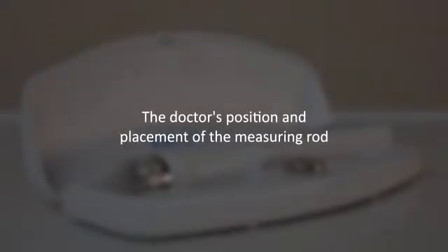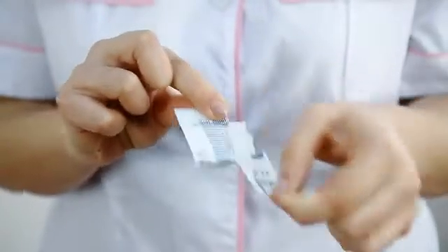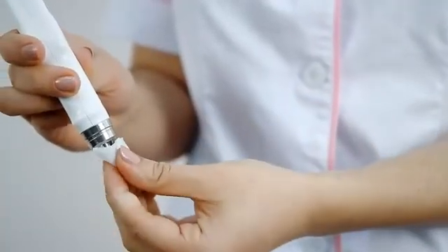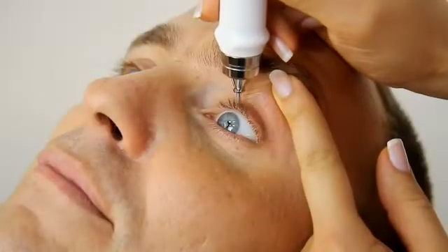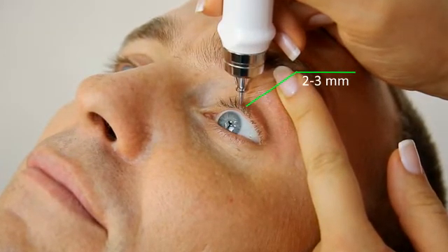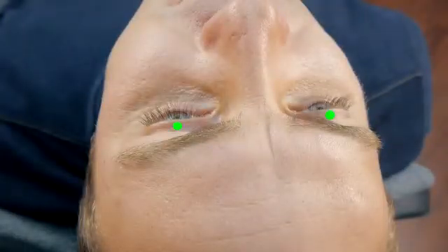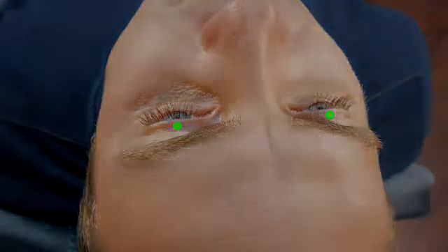The doctor's position and placement of the measuring rod. Please make sure to disinfect the protective ring and vibrator rod before each new patient during the measuring process. The hand holding the tonometer should rest against the patient's forehead. Place the tonometer rod 2 to 3 millimeters above the ciliary margin of the eyelid. Several measuring spots are recommended, which are convenient both for the doctor and patient.